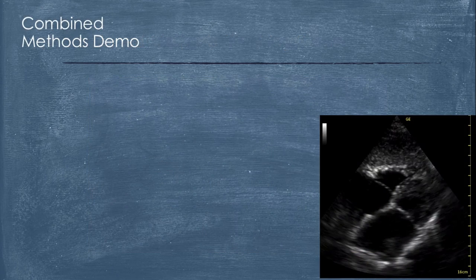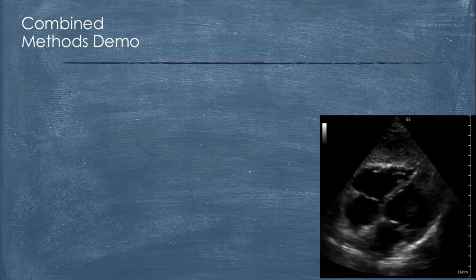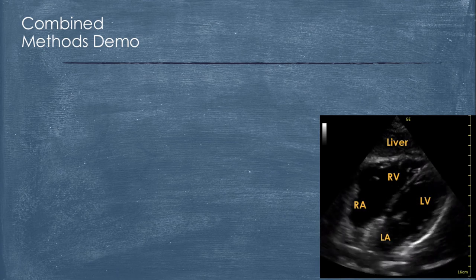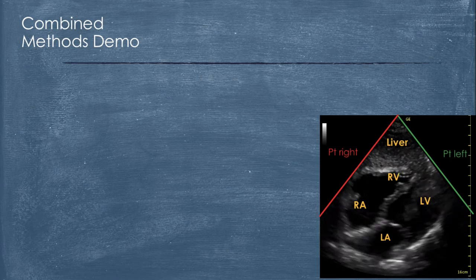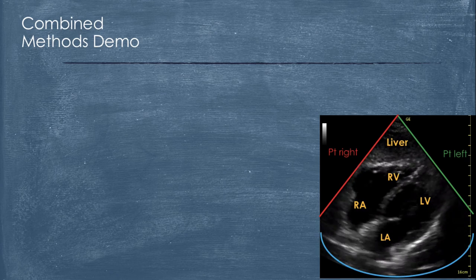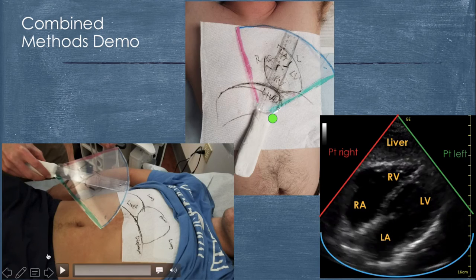And then also here's an example of the sub-xiphoid. So you use a live version of an echo image here. You label it. Keep your orientation in terms of patient left, patient right, screen orientation, probe markers, that sort of thing. And just overlay it. And I find this to be very helpful.